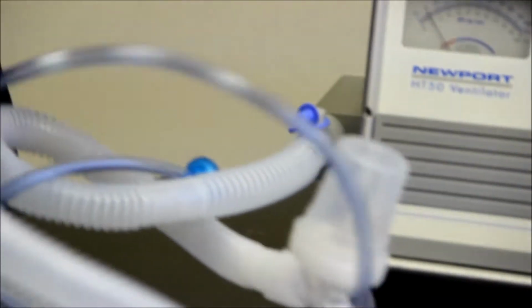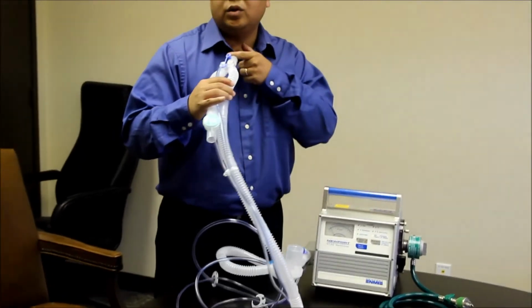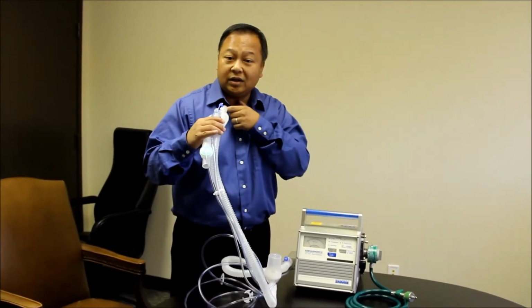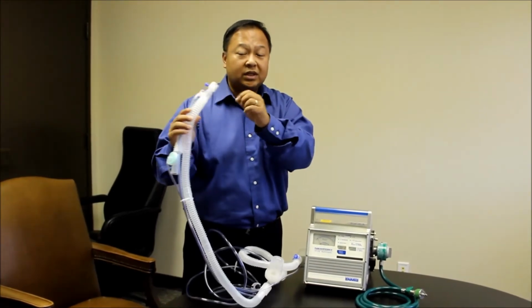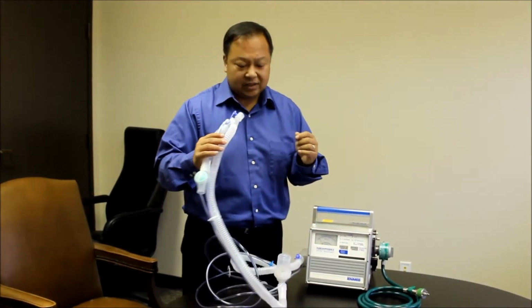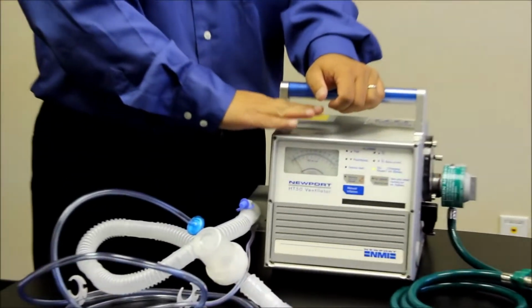And this piece right here will actually go onto your patient. If the patient has a trach, it'll go right here, close to the patient's trach. But if they're intubated, it can connect to the actual ET tube. So this is universal. It can connect to the ET tube or to a patient's trach, depending on what the patient has. All right.